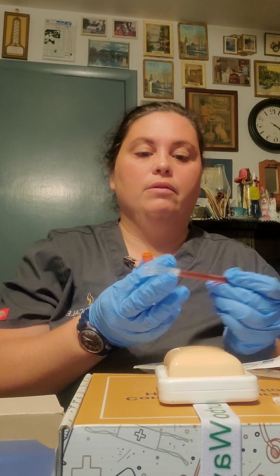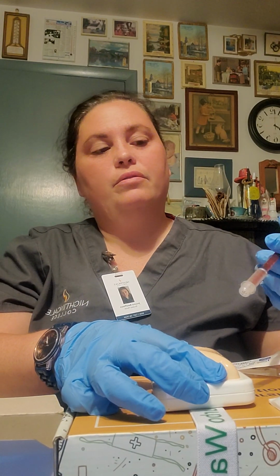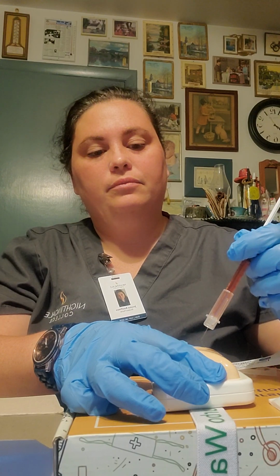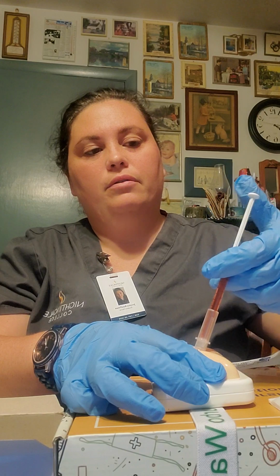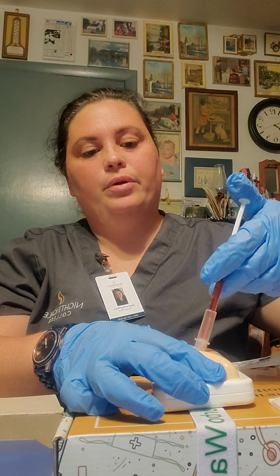and the safety needle came on because this is a safety tip here. Alright, so with sub-Q, I am going to pinch the area. Okay, I'm going to inject at a 45 to 90 degree angle. So I'm going to go about here. I'm going to do a dart motion. Alright, and I'm going to slowly inject the 1 ml of heparin.